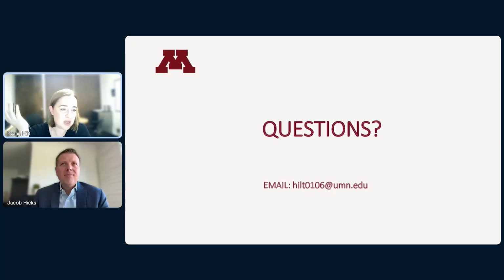An example would be on the trichrome: here's this image, and it could be Entamoeba histolytica. And that's how we confirm or deny based off of that representative image. As for whether we put those images in the actual patient results, no, we don't do that. So I think that captures it.